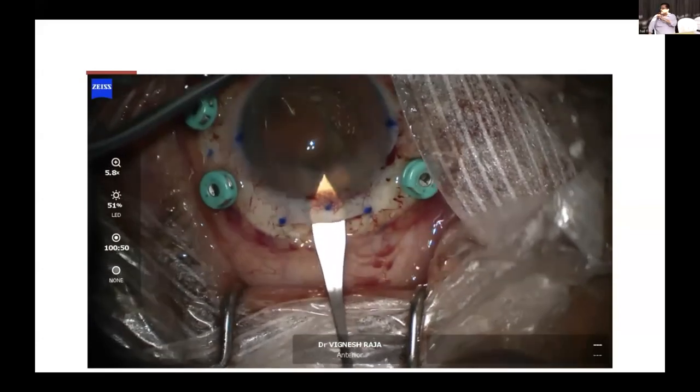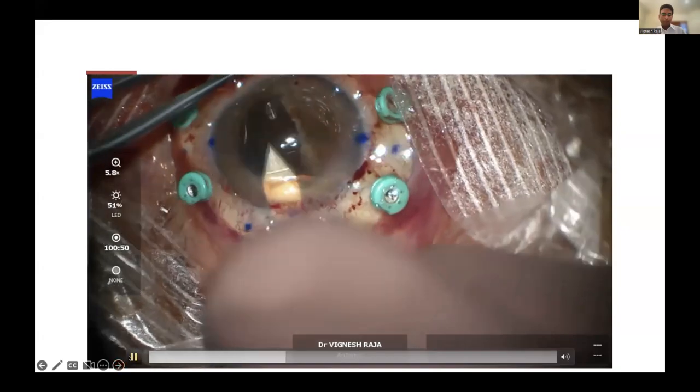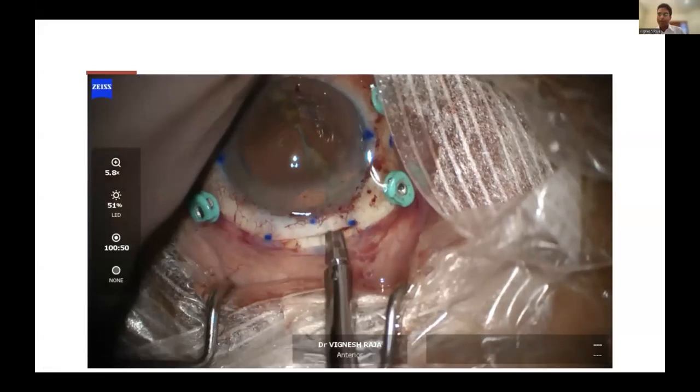So vitrectomy, complete vitrectomy has to be done, is it, for all these? No, sir. In fact, this case already had previous vitrectomy done. This case had previous vitrectomy, vitreolensectomy at the time of the blunt eye injury. They did vitreolensectomy, complete everything, but they just left the iris stump like that because they didn't want to mess around. So when they did the primary repair, they sent it to me for surgery.